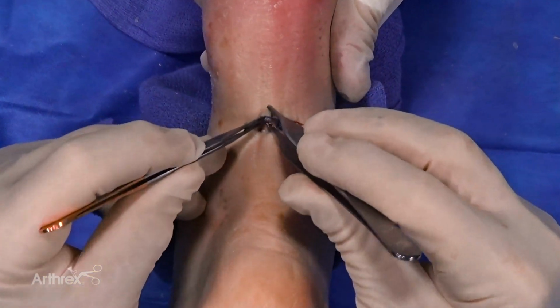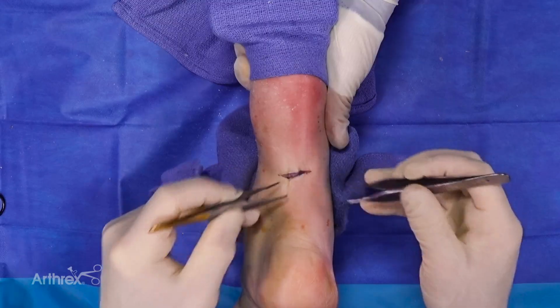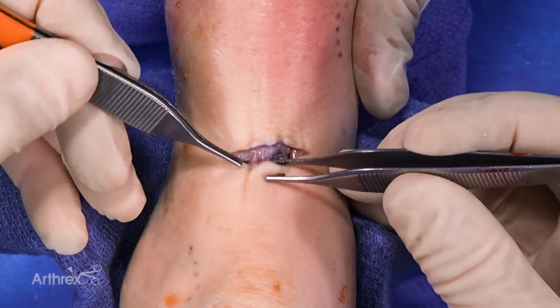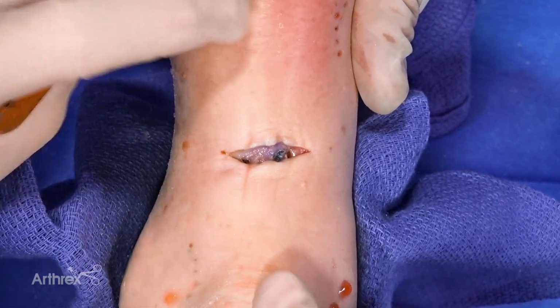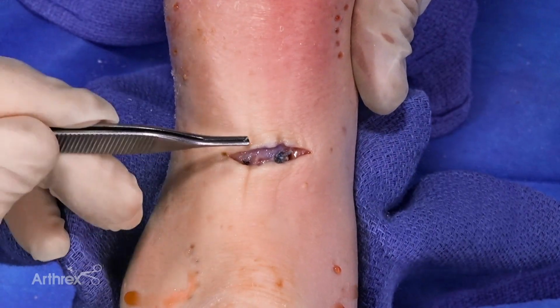I'll lift that pseudo sheath up over my repair, and then I'll just make certain those knots are folded down anteriorly. So once I've done that, I'll take a vicryl suture. I'll basically do a subdermal suture capture, where I'll come in and actually grab the soft tissues above the repair itself, and that will draw soft tissues with my healthy pseudo sheath over the repair itself, and then follow that with nylon sutures.